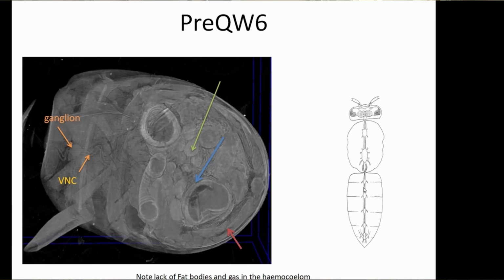It's drawn as being straight, but as you can see, it's obviously quite bendy to go with the bending of the bowel. So abnormal air. I'm going to also be suggesting we're seeing very nicely the Malpighian tubules. We'll see them better in a moment.